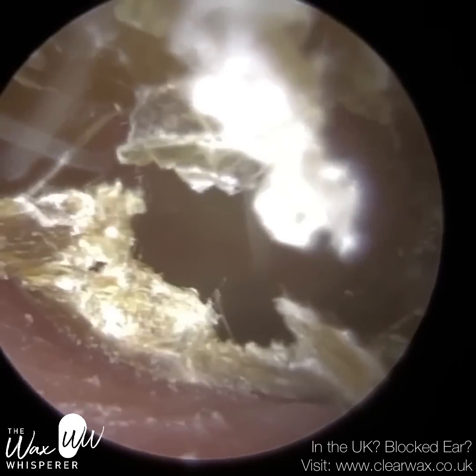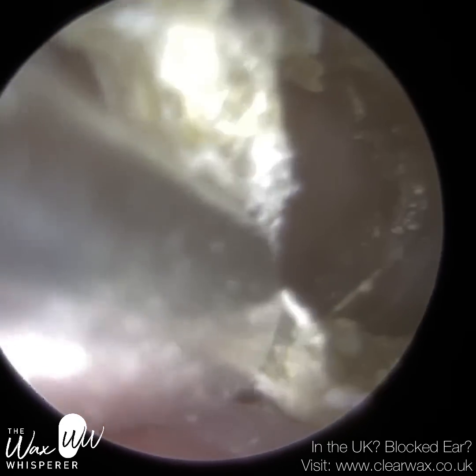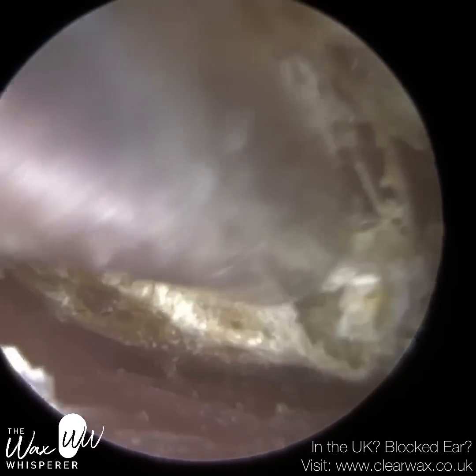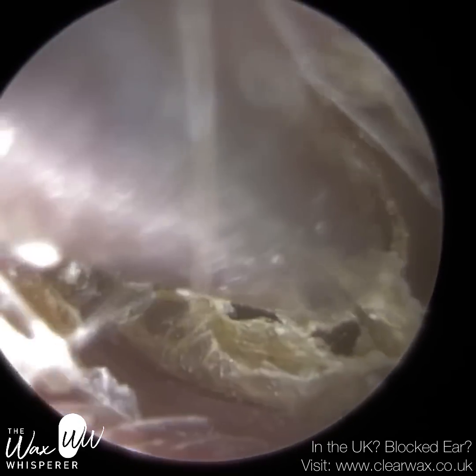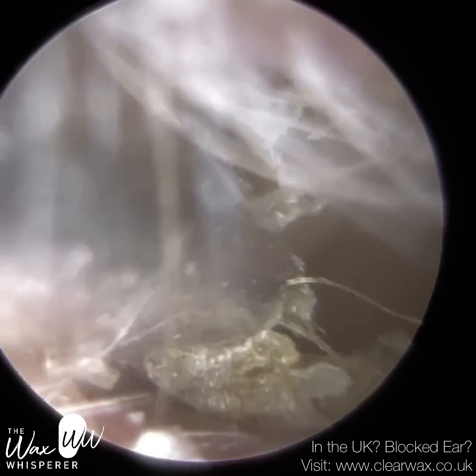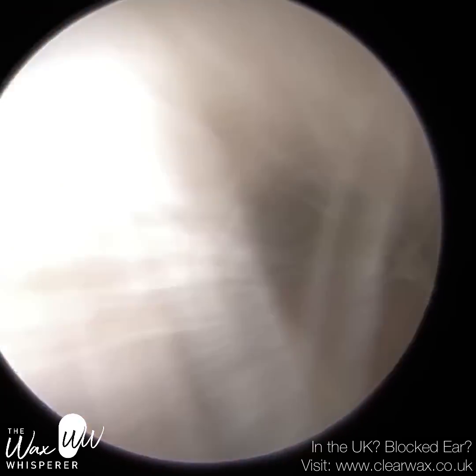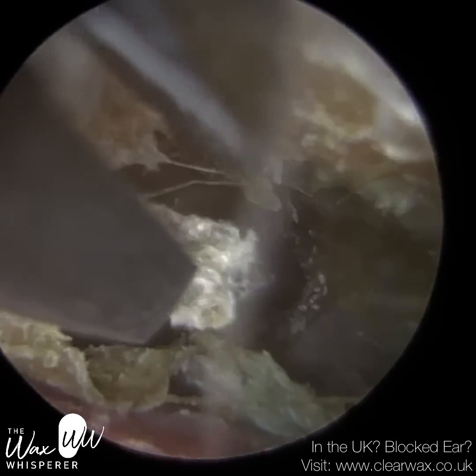It wasn't possible in the end — you'll see that when I'm removing the dead skin off the eardrum. I did manage to remove all of this without introducing any drops initially, but I did have to revert to using drops. The main cause behind this patient's otitis externa is that they actually got water in there — they've been swimming a lot recently and haven't been keeping their ears dry. They also admitted that in the shower they had been getting water purposely in the ear, which led to swimmer's ear, and swimmer's ear is a form of otitis externa.